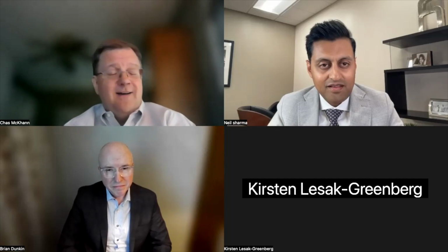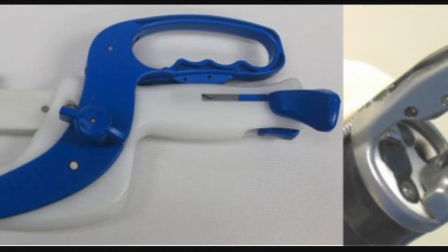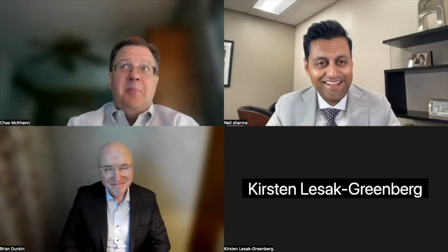And so the first device came out in 2009. It was a Gen 1 device that we've got versions of back at our offices. It's a big, unwieldy device. You have to have hands like a Sergei Kantsevoy to be able to actually even use it. But it proved proof of concept. It proved it could work.